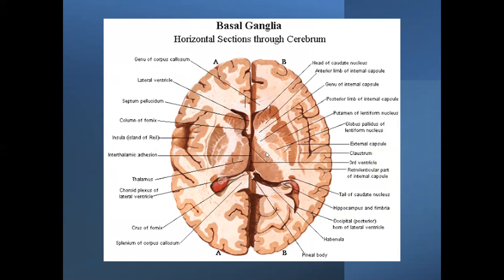The putamen and globus pallidus together form the lentiform nucleus — this is the putamen, and this is the globus pallidus. Lateral to the putamen you can see the external capsule, and lateral to the external capsule is the claustrum. This is the insular cortex, otherwise known as the fifth lobe of the brain.